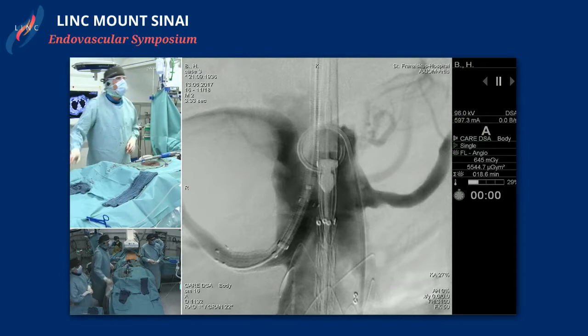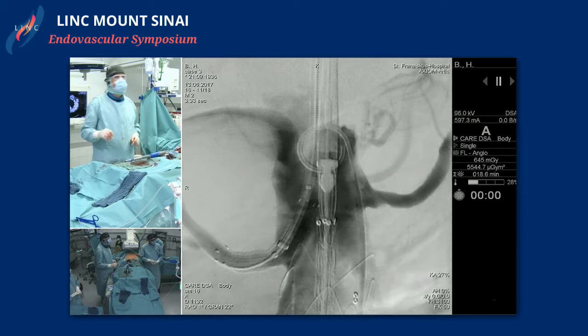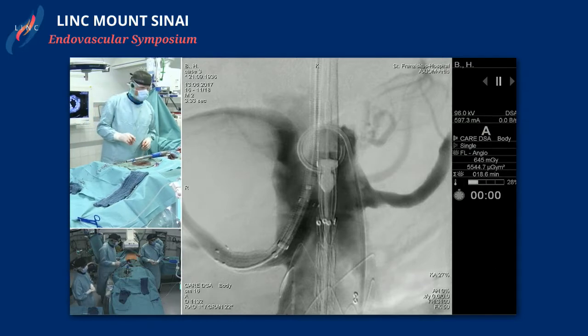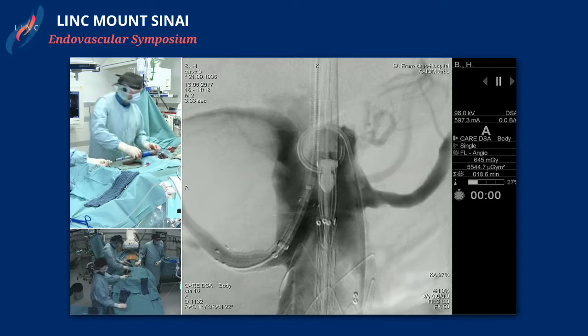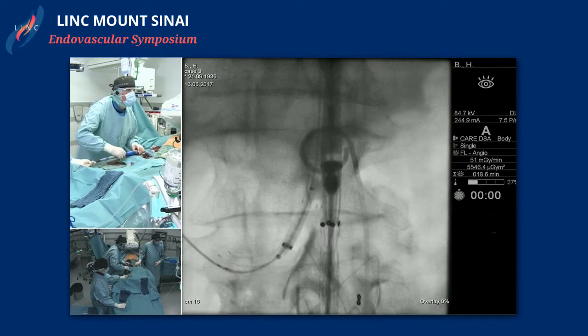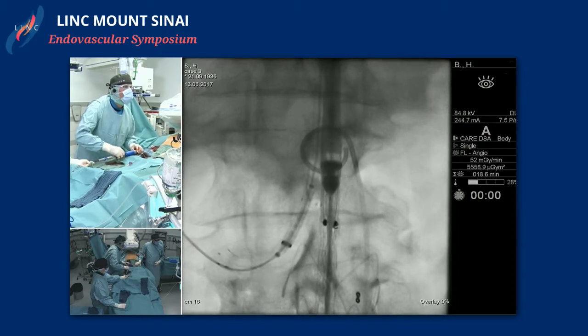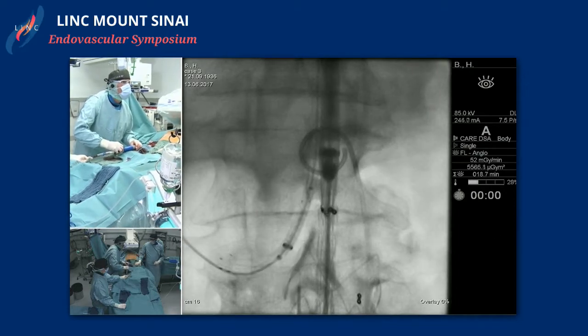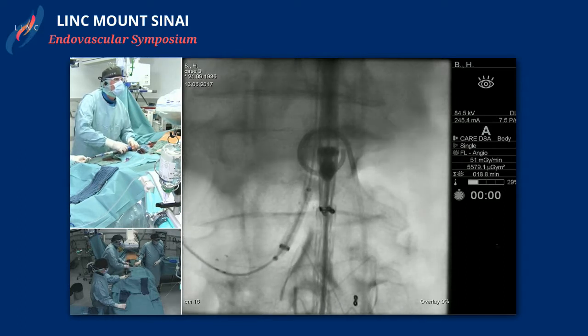Well, I do like how you've changed your angle to really line up your stent grafts so you know exactly where it is and there's no parallax. I think that's an important key also, that you don't want it deploying on an oblique angle. And really at that point, you're maximizing that neck that he's trying to use. I mean, he can get really to the edge of that left renal artery, which if he takes it to that level, he's right at the level of his Viabahn.